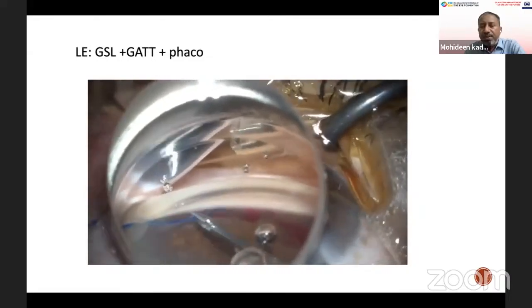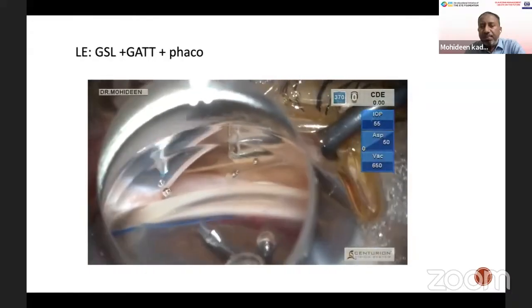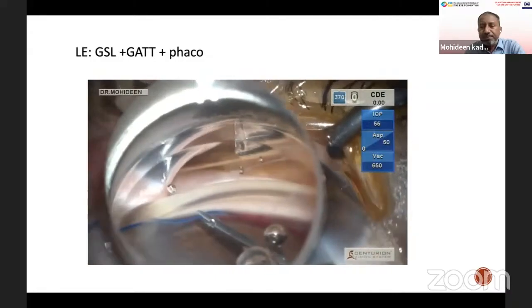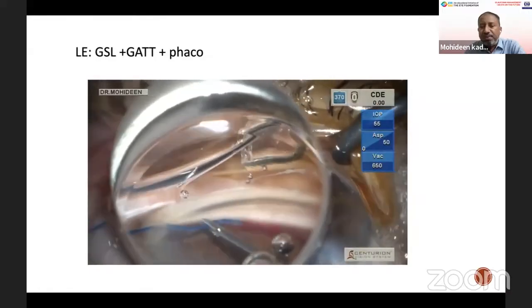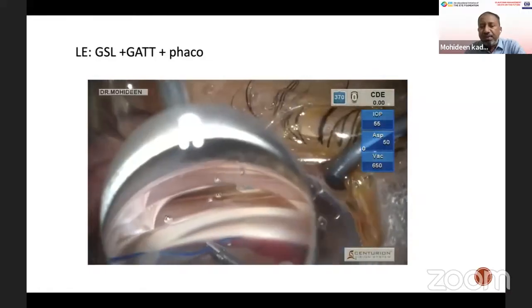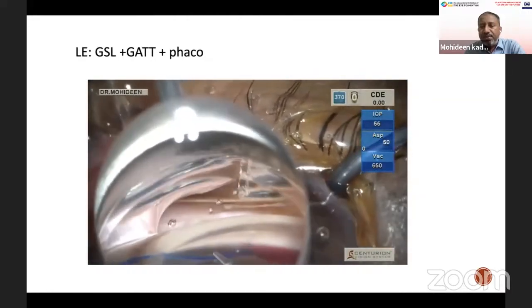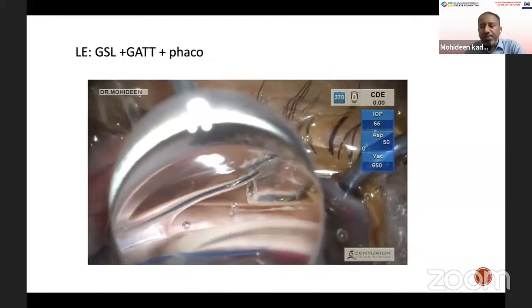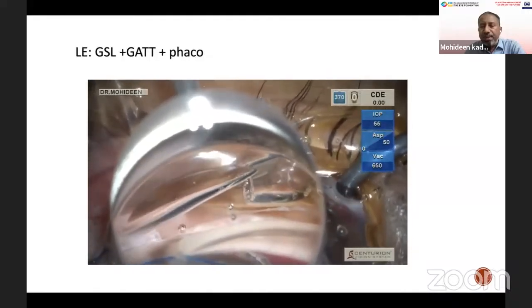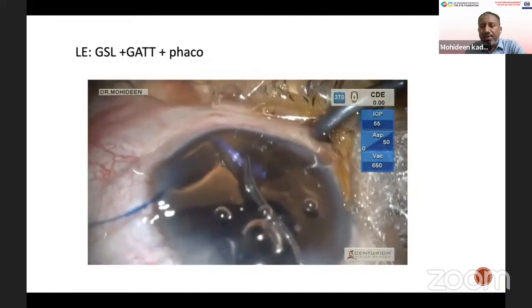Then when you look at the suture from the other side, just grab it off. Then you're happy, and you can just wait for the suture to come out. So once you know this is going to come out, pull the suture from the other side and pull it off. So then you complete just pushing, because there's some resistance there, by pushing and just removing the last part of the sutures. So this is taken out and then just repeat.